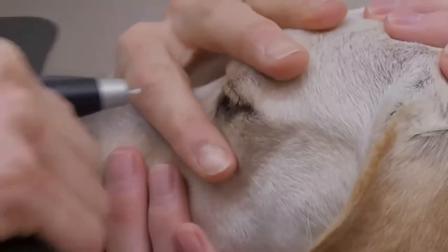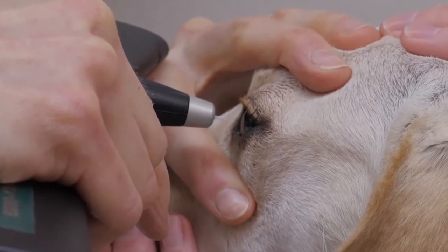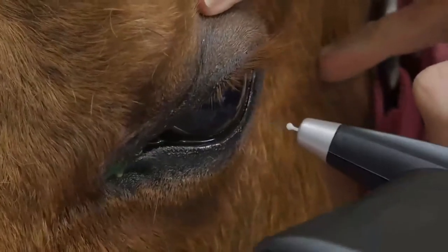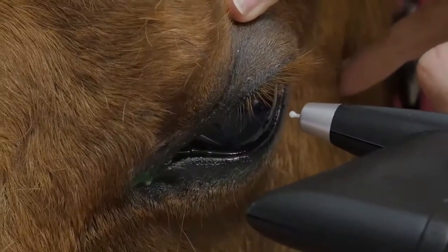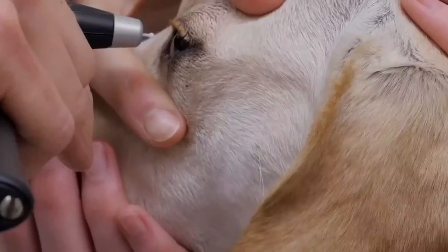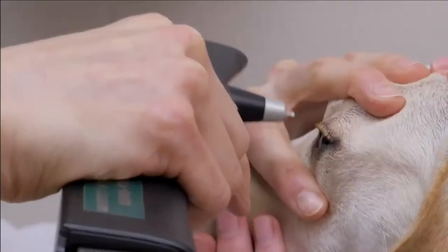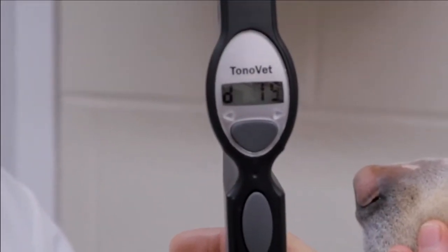To perform rebound tonometry, the tonometer is held a 1/4 inch from the corneal surface, and each time the button on the instrument is pushed, the small probe rapidly reaches out to touch and rebound off the cornea. Several measurements are taken, and a small beep is heard when each successful reading is obtained. Once 6 readings have been taken, a longer and final beep is heard, and the final average reading of intraocular pressure is displayed.